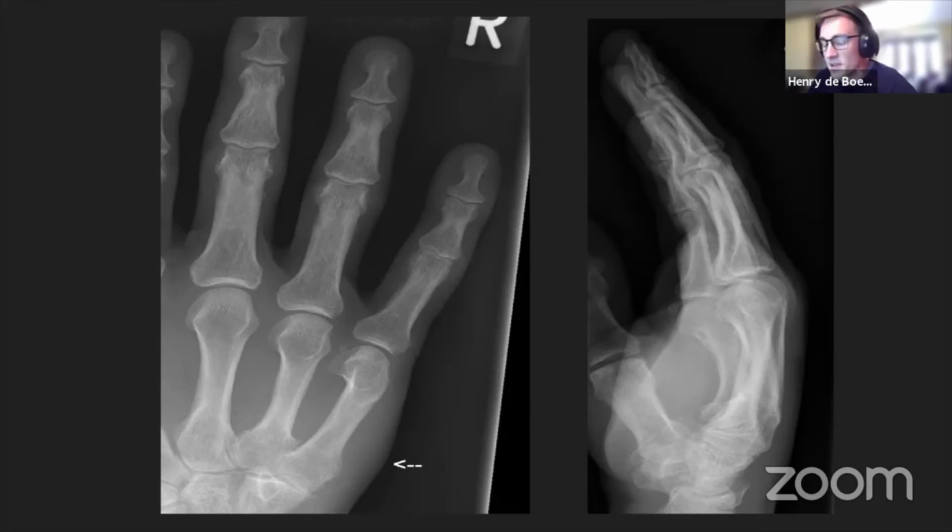So I can see we've got 10 minutes left. So try and pick up the pace slightly just so we can get through as many cases as possible, because I think the more that we can see, the more useful this will be. Please keep those answers coming. So let's have a look through together.